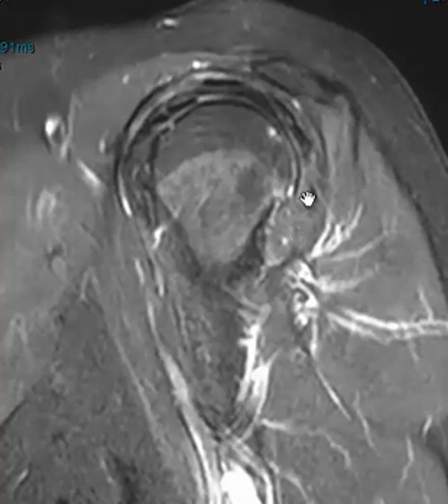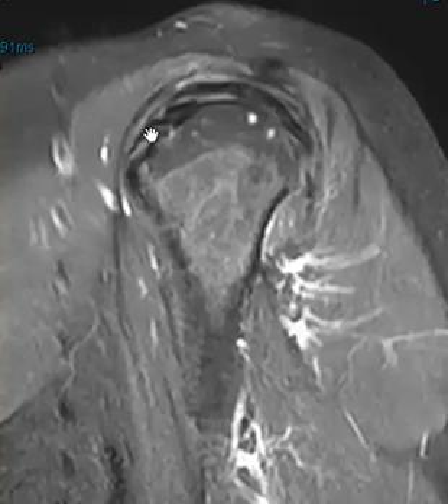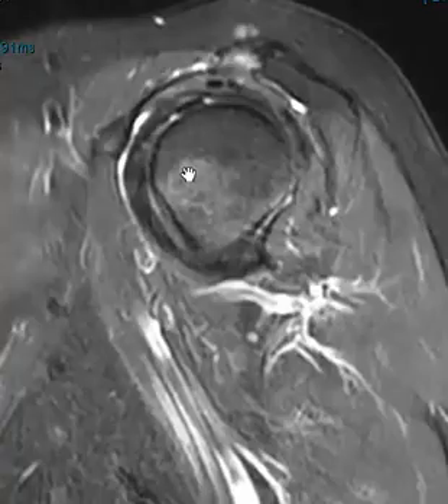The back here is posterior. This is the teres minor, this is the infraspinatus, this is the supraspinatus. These are all looking pretty good. And if we get over to the subscapularis tendon, this is it — looks pretty good back here.